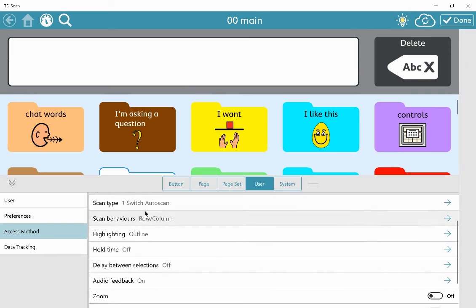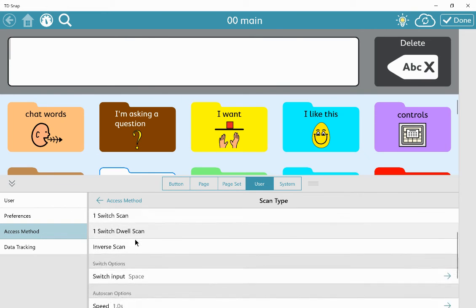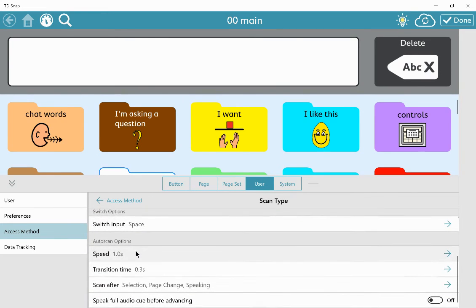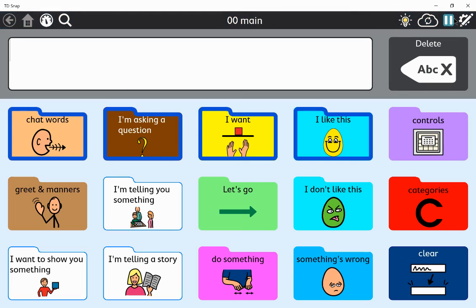Going to switch auto scan. And I'm just going to change it to speak full audio queue before advancing. Let's see if that's better.